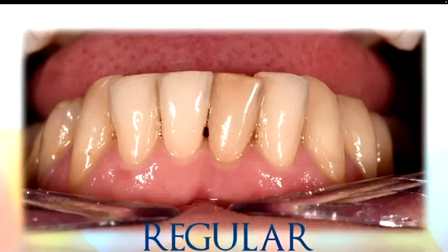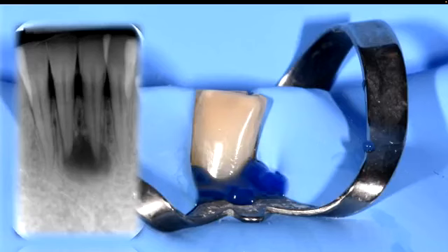This is a case of a regular shape. You see these lower incisors. You see there is one that's extremely dyschromic. The patient was sent to me by a colleague asking me to treat both incisors because he saw the X-ray. There was a large lesion and both teeth were not responding to the vitality test, but I'm not sure that is due to both. So I spoke to the colleague, I spoke to the patient, and together we decided to treat first the tooth that was evidently dyschromic. And there was no doubt that this tooth was necrotic.